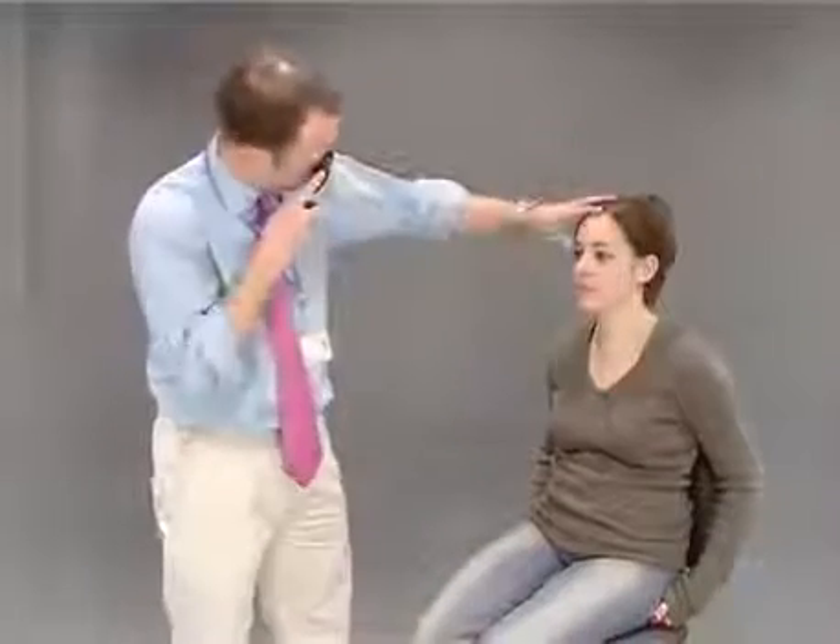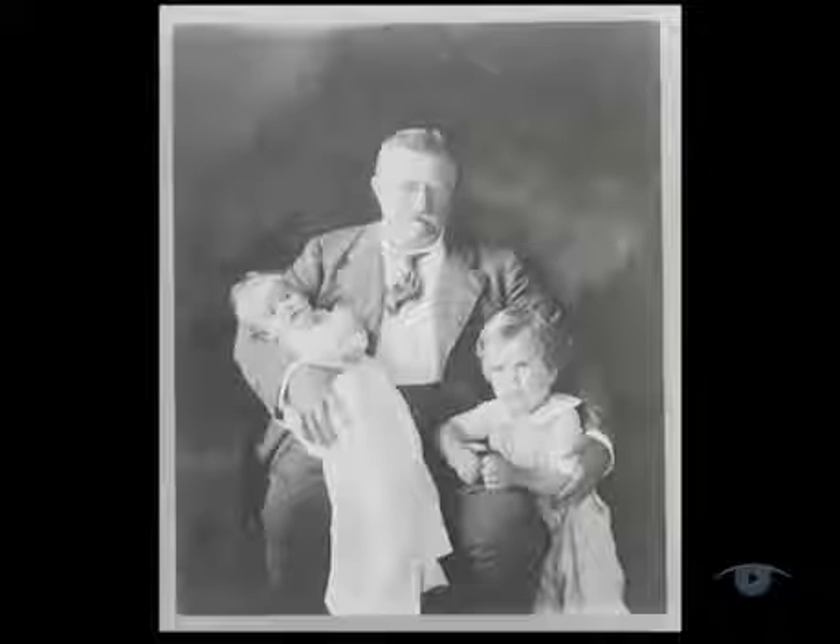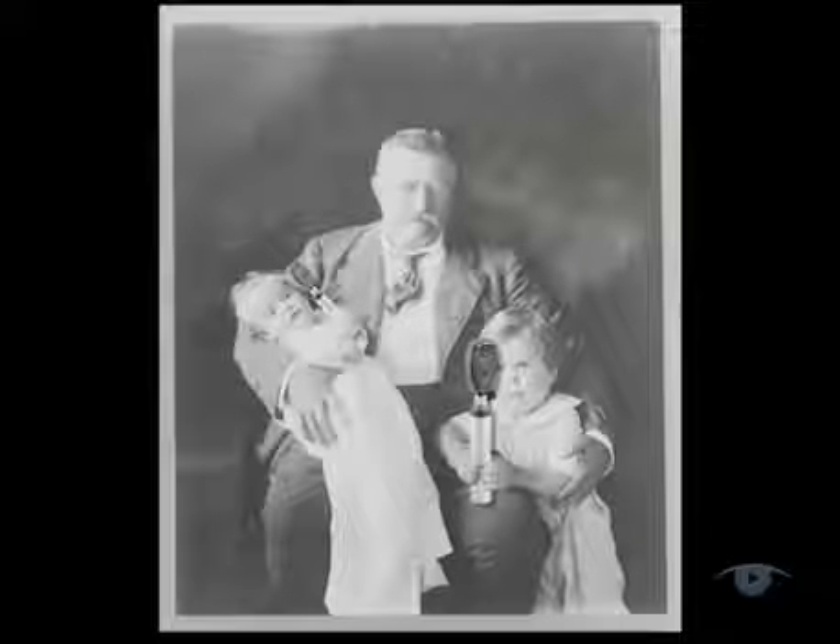Finally, you should realize that as with any clinical skill, proficiency comes at a cost. You need to practice ophthalmoscopy regularly to develop and maintain the skill. Try to get into the habit of using it routinely as part of your normal examination. The sooner you start, the quicker you'll get up to speed.